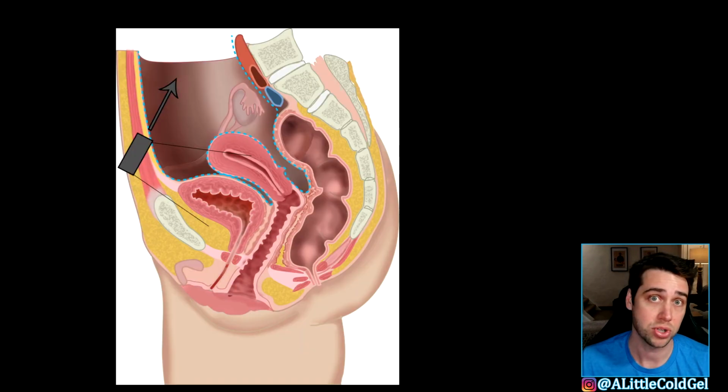Now, the last portion of a renal scan is to check out the bladder. So the problem I see people getting into with the bladder is the pelvic bone right here. So this pelvic bone will cast a shadow from the ultrasound. It won't be able to get sound waves through it. So you have to go above it. So sit right above the pelvic bone and aim inferior. So you really have to go kind of deep inferior into the pelvis to see the bladder.